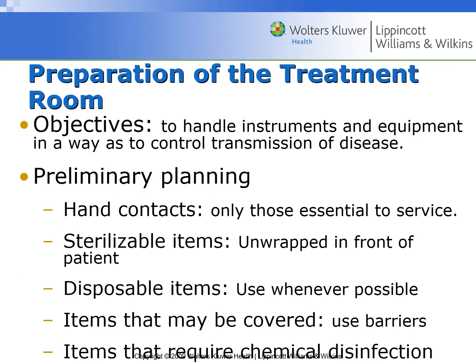Preparation of the treatment room. Objectives would be to handle the instruments and equipment in a way as to control any kind of transmission of disease, of course. So you're going to be always planning for this. And hand contact, you want only those essential to your service to your patient.